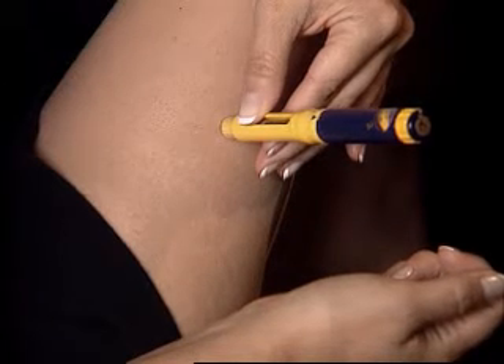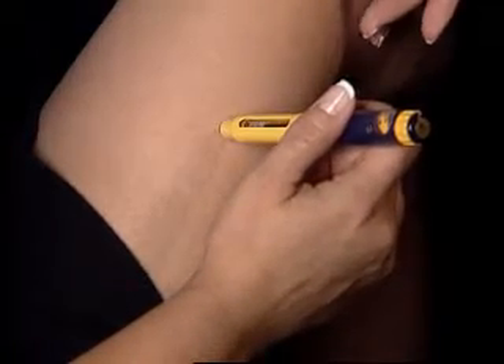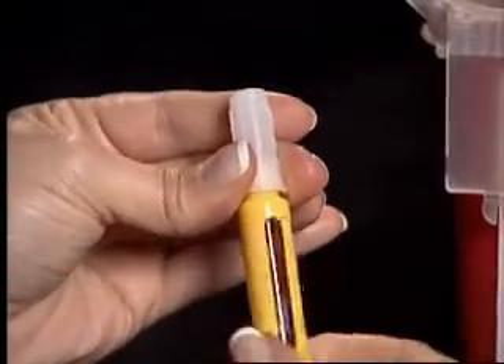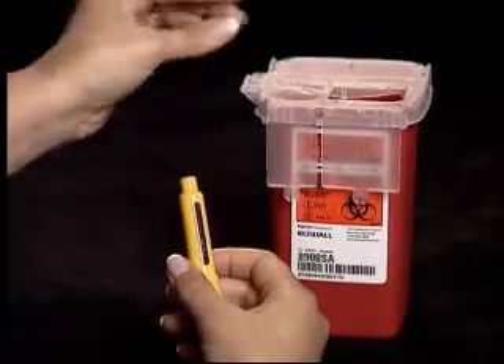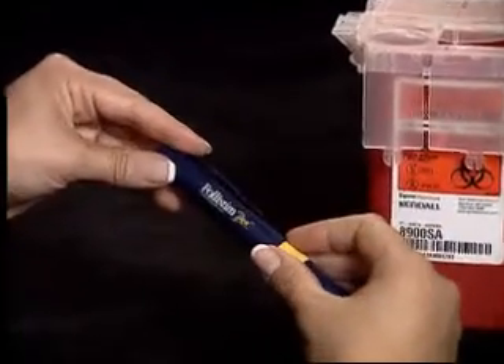When the injection is complete, quickly pull out the pen. If bleeding, wipe with a sterile gauze pad. Carefully replace the outer needle shield onto the used needle and twist off. Place your used needle into the sharps container. Store your pen with your supplies for future use.